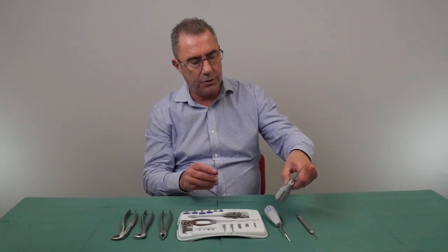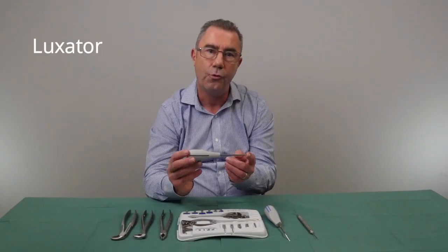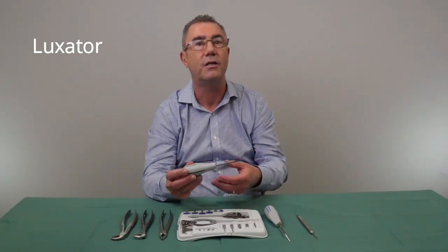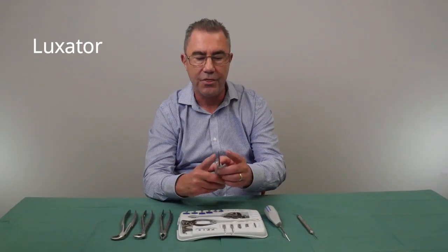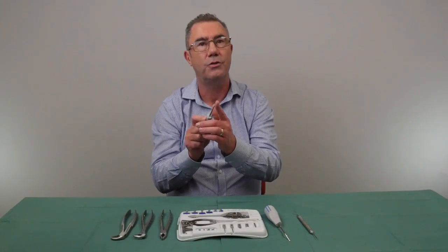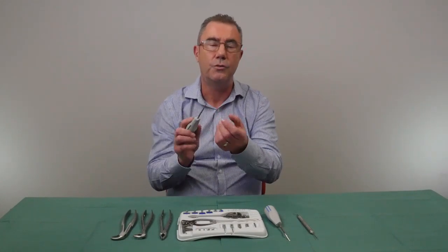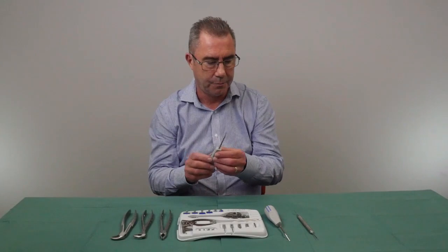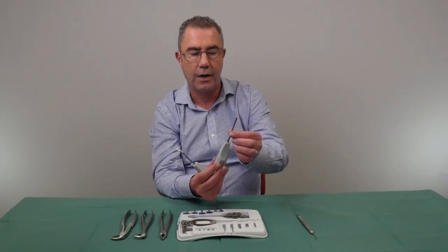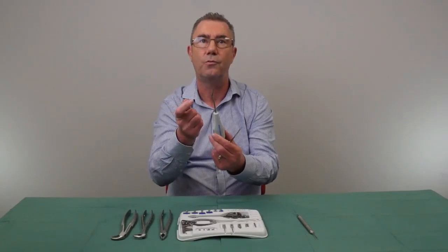The next instrument is called a luxator, and this is like a halfway house between a peritome and a conventional elevator like a Coupland's. It's a lot thinner and designed to enable you to gain access along the long surface of the root and to cut the periodontal ligament so that the tooth is loosened. They are available in straight or angled options with different curvatures and widths.